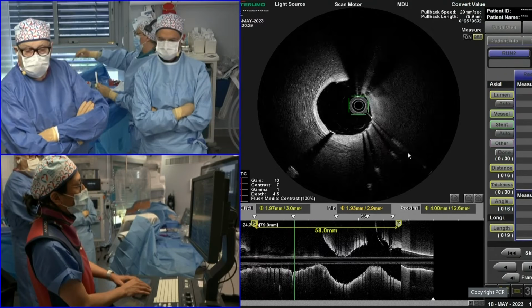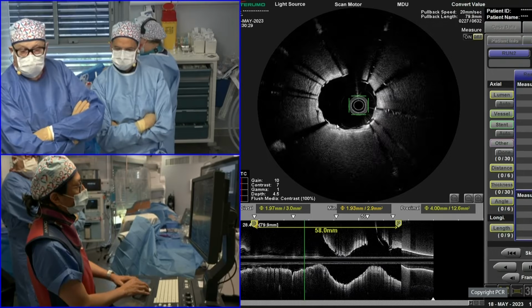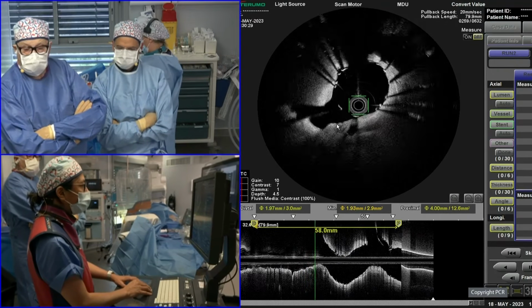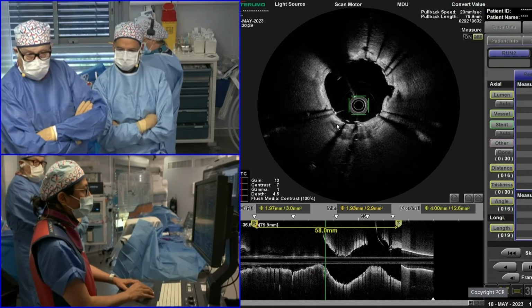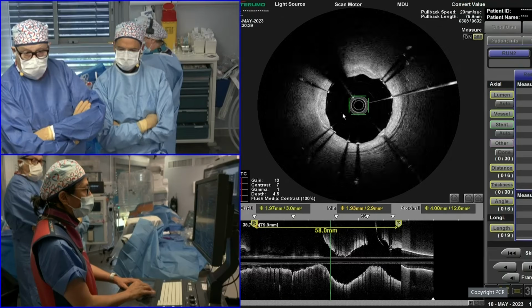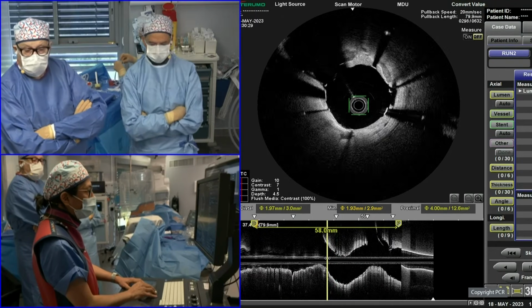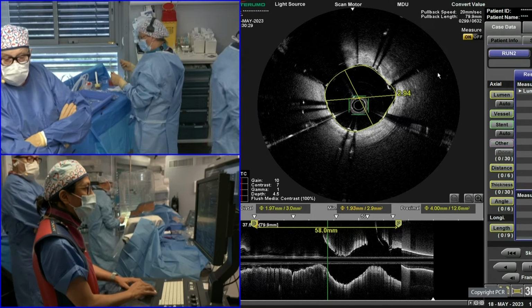And then, of course, you review the whole stent and you look for two things: malapposition and stent under-expansion. Of course, OCT is very, very sensitive, so it will show you any malapposition, and you don't need to react to most of them, because most of them will be covered. This is early malapposition that will be covered by tissue anyway.